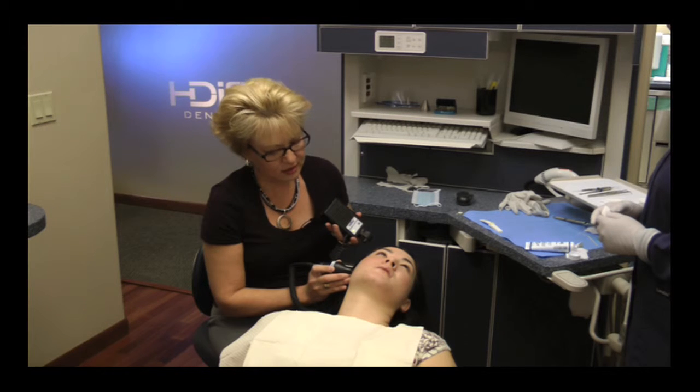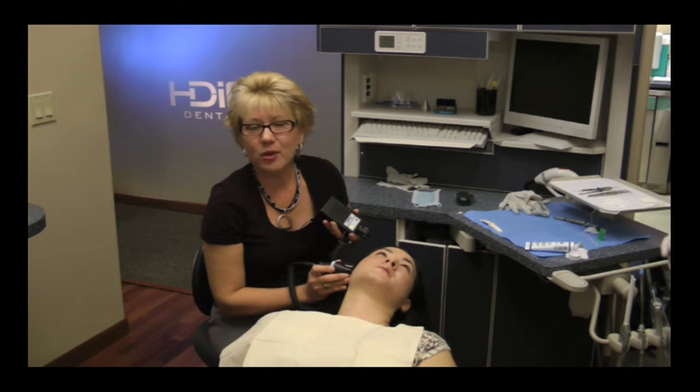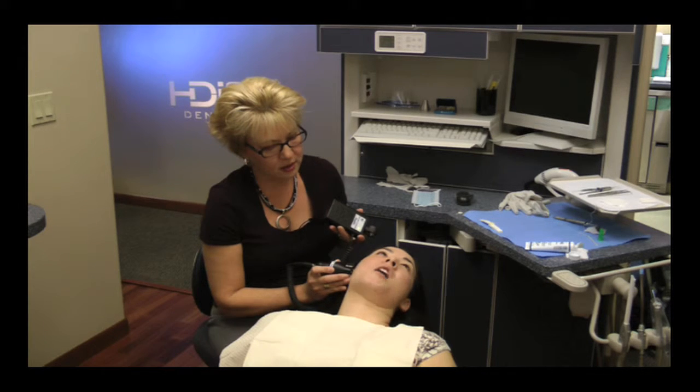Okay, now I can listen to translation. So now what I'm going to do is have Katie open to the full extent, but I'm only going to pay attention after she gets out of rotation. So Katie, take about a second to open and a second to close, but open to the full extent that you can. One thousand one, open and close. And one thousand one, and close.